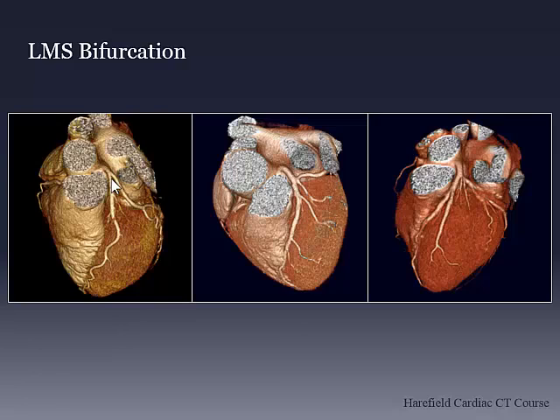They're like, wow, this is amazing. Obviously, the wow factor of CT, it's been a few years now that we've had volume rendering. But you still see people saying, oh, that's amazing. And you're like, yeah, whatever. Okay.